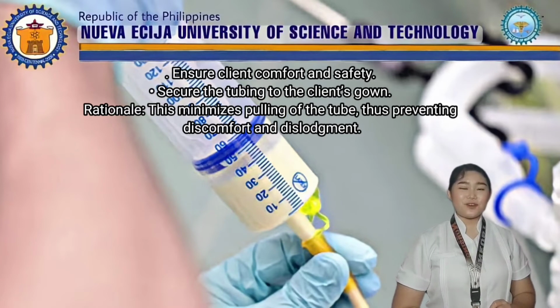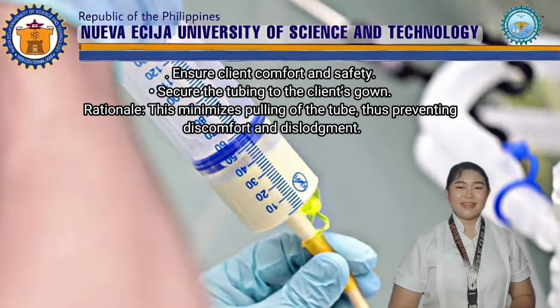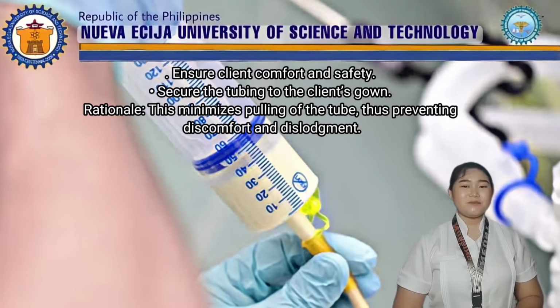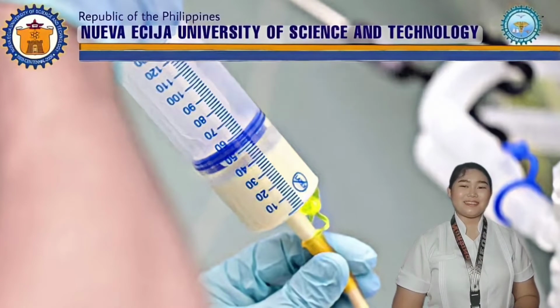Ensure client comfort and safety. Secure the tubing to the client's gown. Rationale, this minimizes pulling off the tube, thus preventing discomfort and dislodgement.